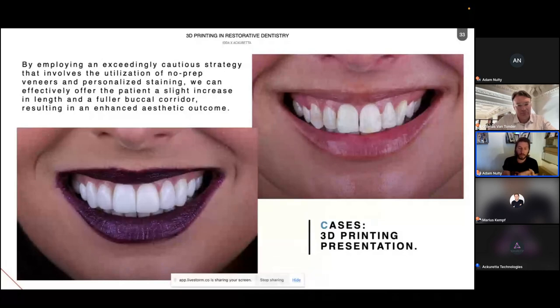It might be financially for the patient. It might be for speed. It might be for overall budget with another case involving something like alignment. It might be where we just need to do edge bonding or something like that. And the materials we have now can allow that to be more predictable versus trying to make do with the transfer of a model to the patient, which is never easy.